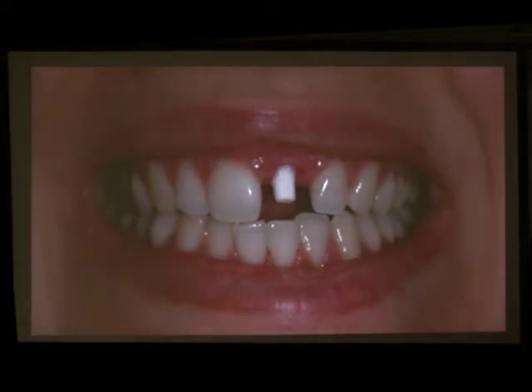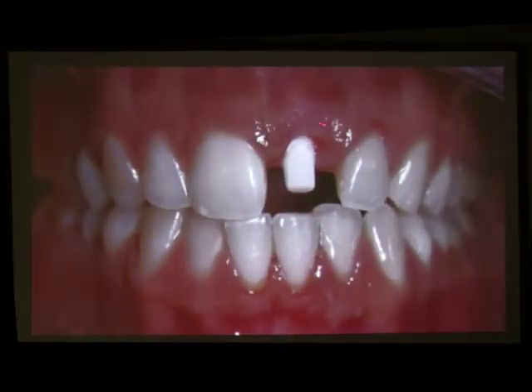And in the anterior zone, if patients want maximum aesthetics, they always go without temporaries. So for patients who complain, and they want a temporary crown on the implant, we tell them that yes, you will be more comfortable, but you will have less gum if you have a crown placed on the implant since the day of implant placement. If they want maximum aesthetics, they have to stay without crown. And when they stay without crown, the gum creeps down. When we put a temporary sitting on the margin of the implant, the gum doesn't go anywhere. The gum stays at the temporary crown level.